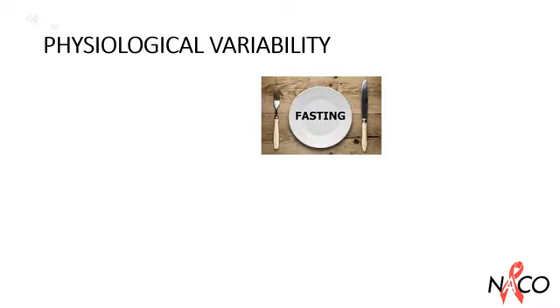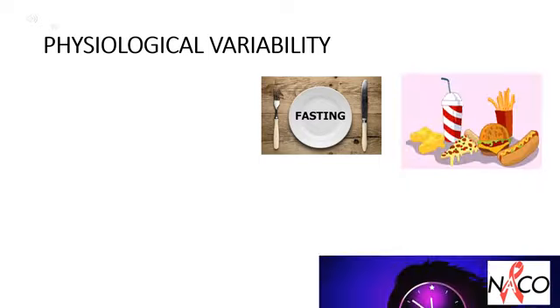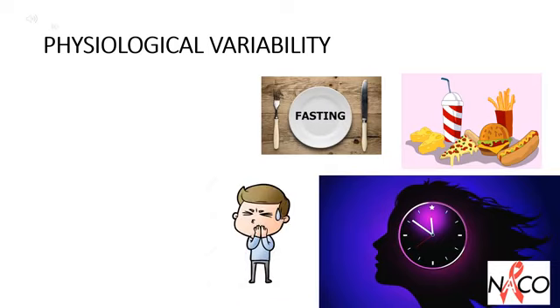Majority of tests do not require any specific patient preparation. However, a fasting morning specimen is preferred for many of the tests performed on serum, plasma or whole blood. Several changes in values can happen due to physiological variables. Examples of physiological variations include food intake, circadian rhythms, travel, sweating, prolonged bed rest, posture, environmental factors, and seasonal influences. A few precautions are suggested to ensure best results.